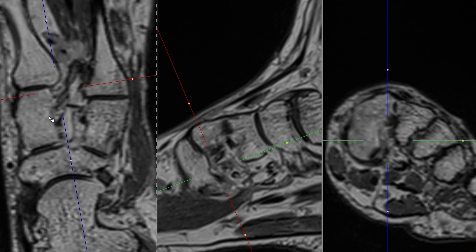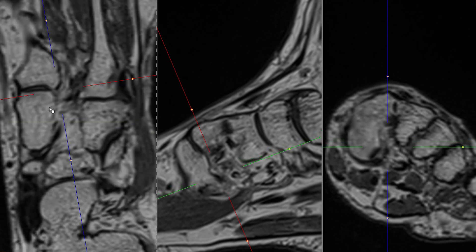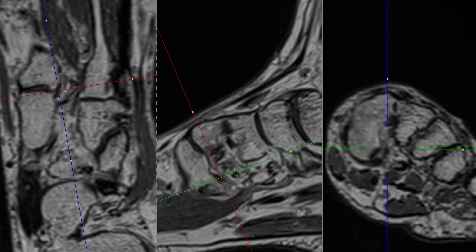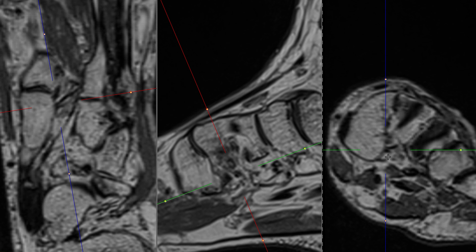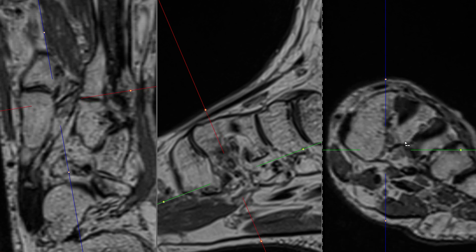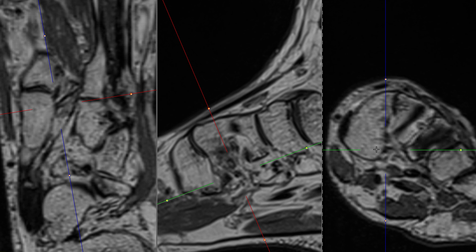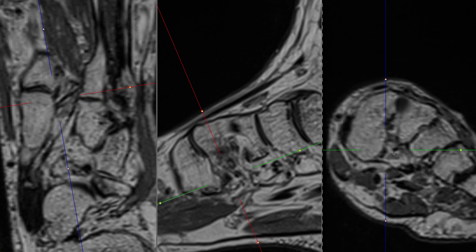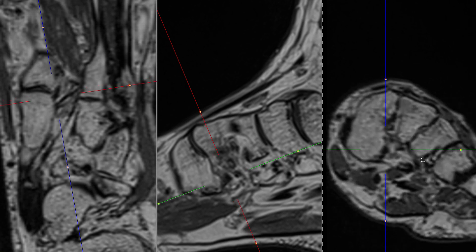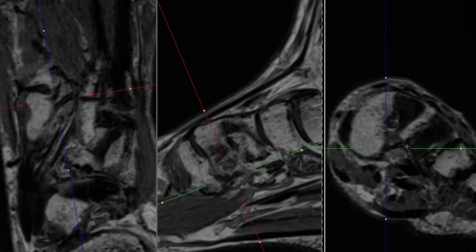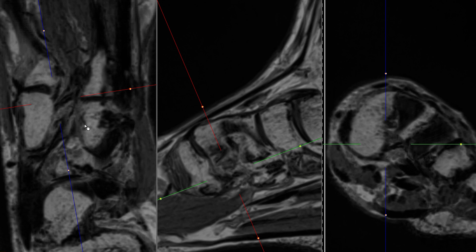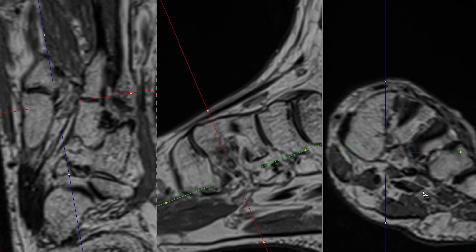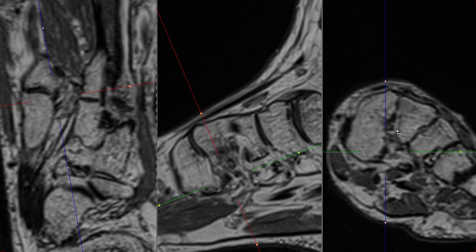Going even further plantarly, we are now at the level of the base of the medial cuneiform, and we can see the plantar Lisfranc ligament. It's best seen on the short axis view, where you have two fascicles — one running from the medial cuneiform to the base of the second metatarsal, and one to the base of the third metatarsal. This minimum intensity projection view shows the y-shaped ligament clearly.